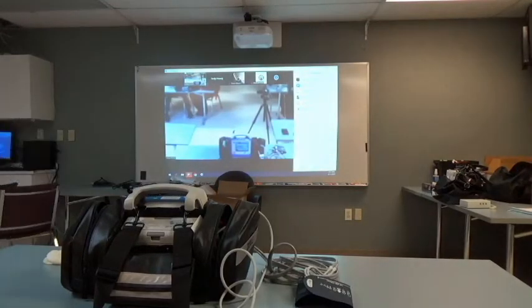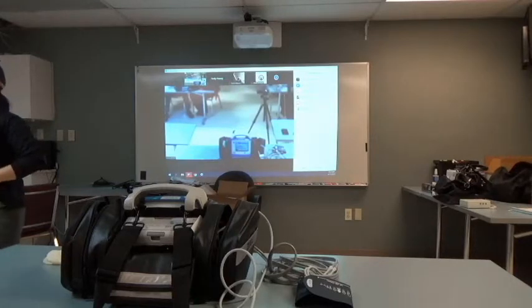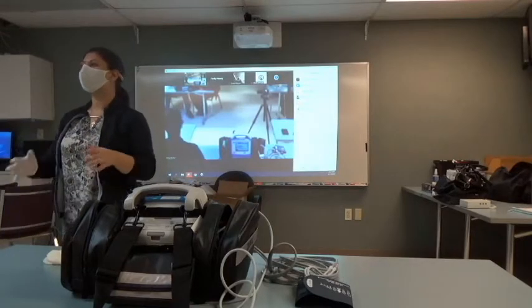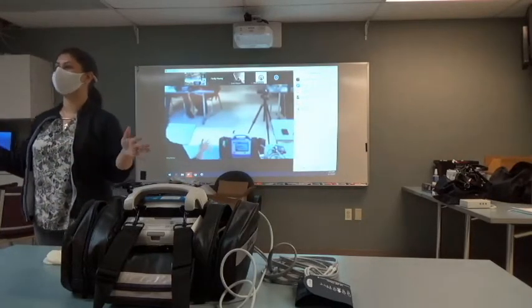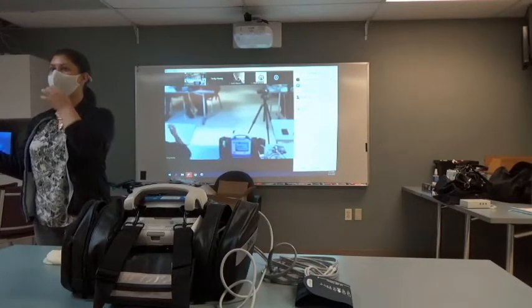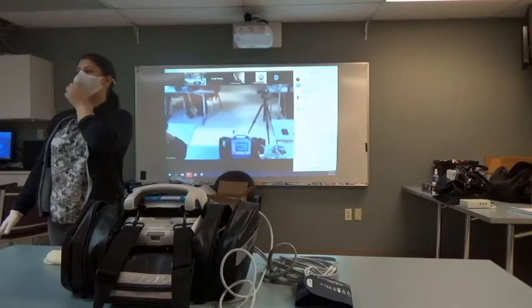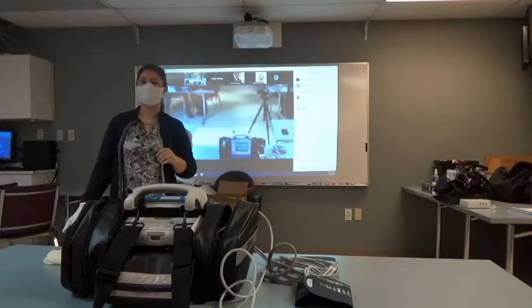Yes, sir. At the bottom of the blood pressure menu, there's a scale that goes to 300. It's just the blood pressure inflation. It's already set in the background for the adult patient. Okay, so it's already set. There's nothing you guys will have to do with it.